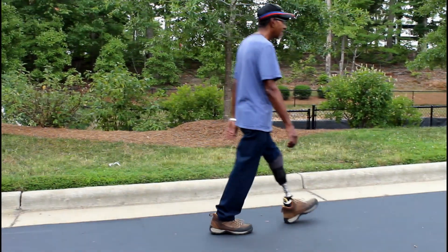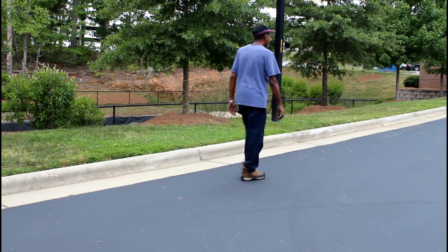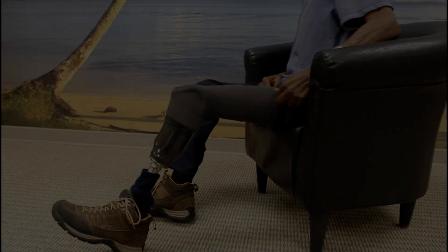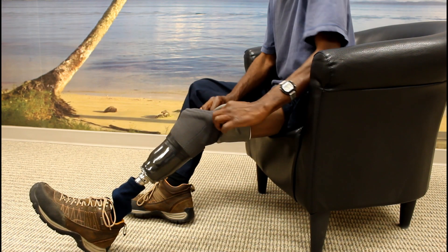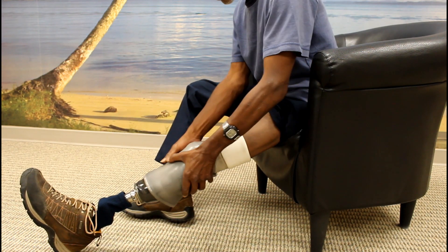Once you have pushed your limb into the bottom of the socket and rolled up your suspension sleeve, you are ready to use your prosthesis. As you walk, air will be removed from the system and you will be able to feel the increased sensation of security as a pressure difference is created between the inside of your prosthetic and the atmosphere. To remove the socket, you simply roll down the suspension sleeve and allow air to re-enter the system and then push the socket off your body.